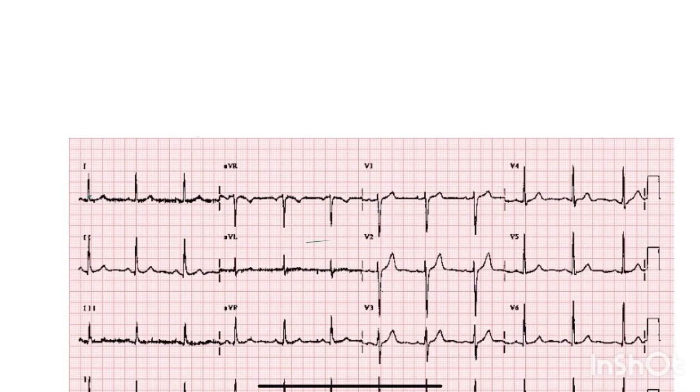Hi everyone. So in this video we will understand basic ECG interpretation.